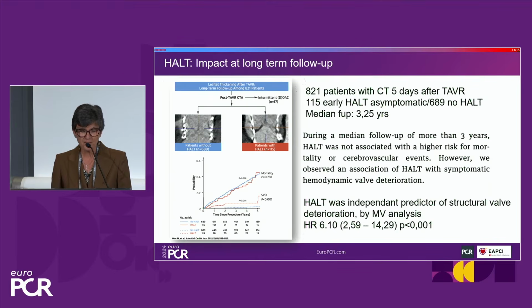There is one paper, very, very interesting, coming from Germany, published recently by Hein, with a follow-up of more than 3 years among patients undergoing a successful TAVR with no problem. They performed a routine CT scan 5 days after the TAVR, and among the cohort, 115 patients had early HALT but were totally asymptomatic. And they were followed during 3.25 years, median follow-up, and you see the results on the left part of the slide.